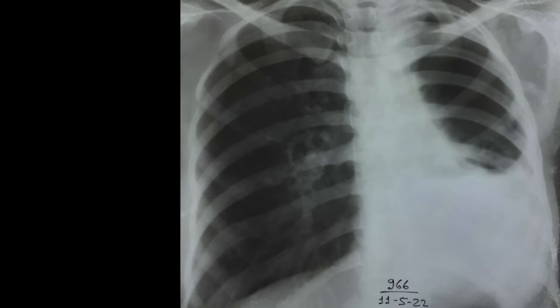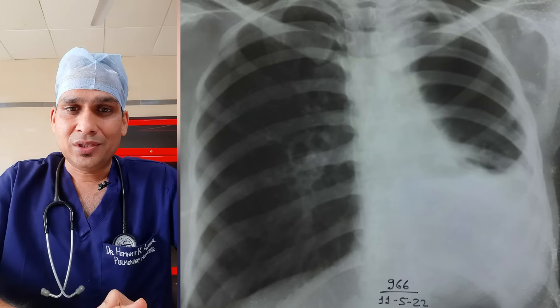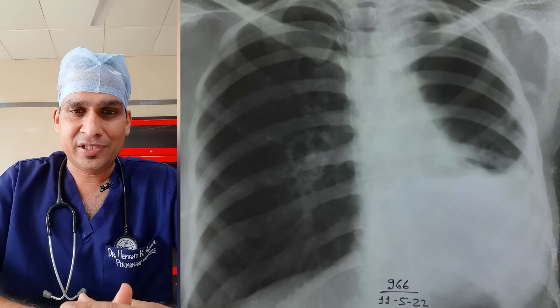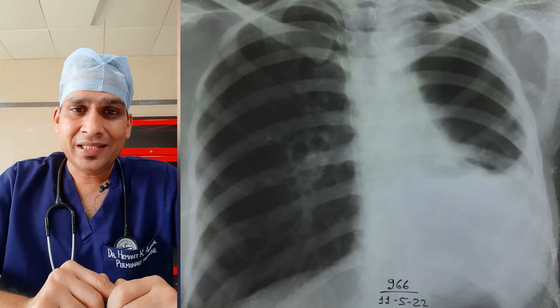Now let's see a live demonstration of chest tube insertion in a patient. This is the X-ray of the patient — a 36-year-old female with symptoms of one year duration. You can see pleural fluid collection on the left side with mediastinal shift on the same side. On the right side there is compensatory emphysema, meaning the patient has a long-standing disease with lung fibrosis. We will examine the pleural cavity by ultrasound and mark the site for chest tube insertion.